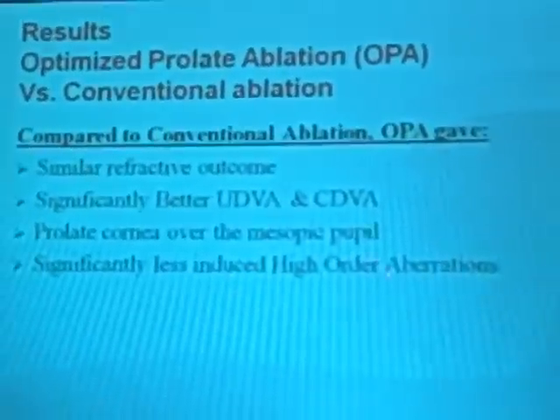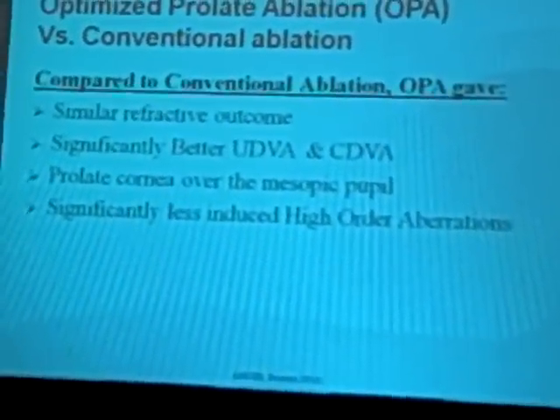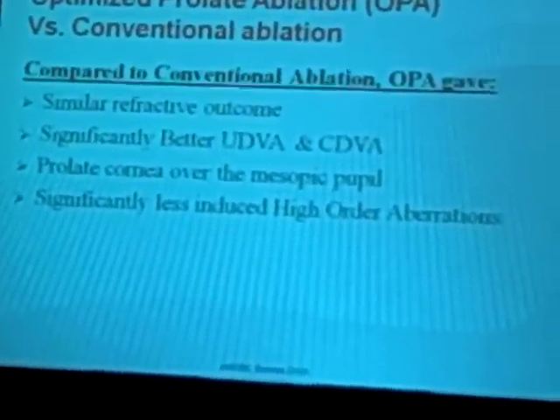So that's why you were glad to get up early this morning. So we have a similar refractive outcome, better visual outcome with OPA, and a prolate cornea afterwards with less induction of higher order aberrations with this custom designed topography plus wavefront software that Nidek calls OPA.